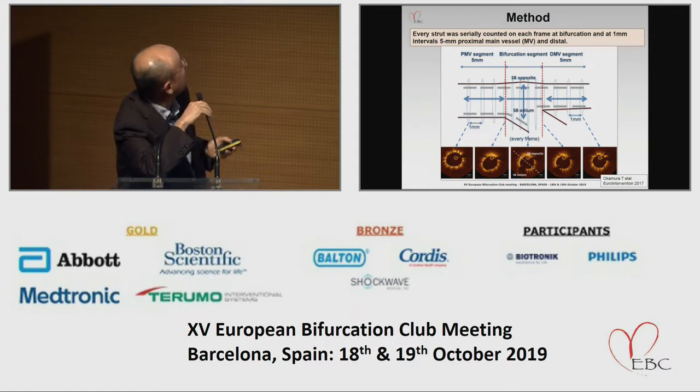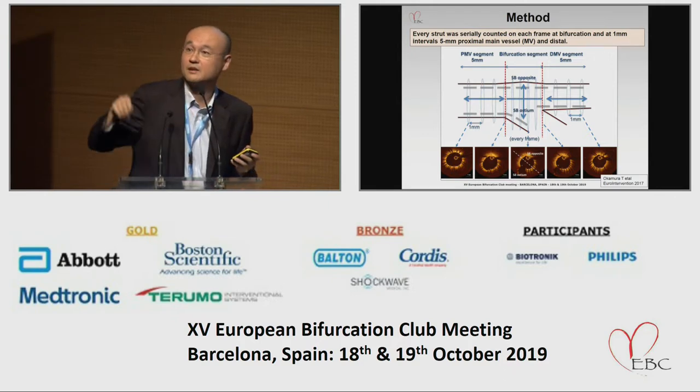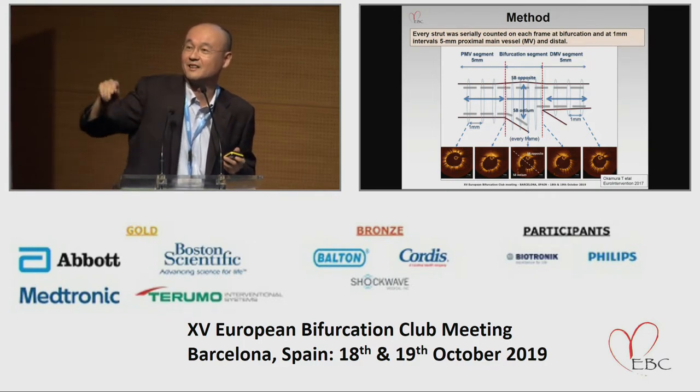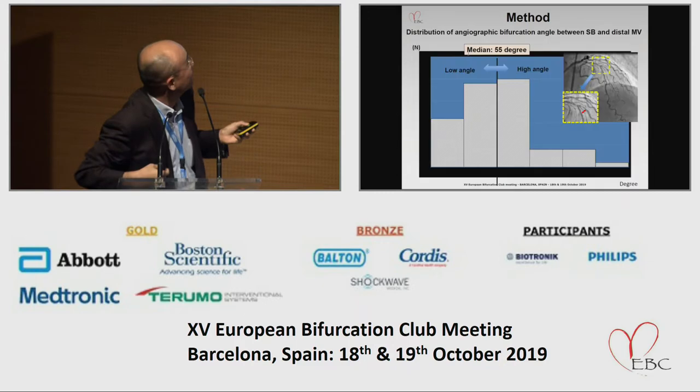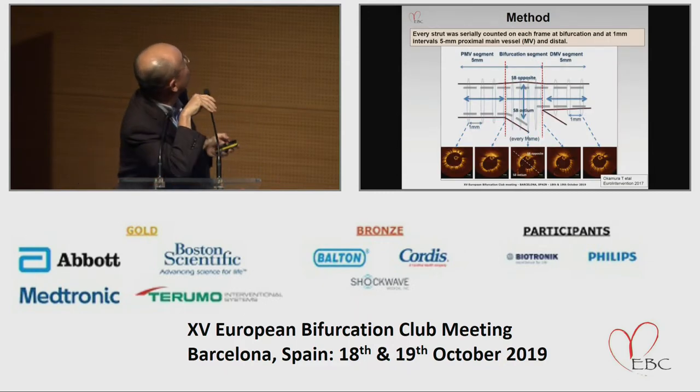In this registry, every strut was serially counted on each frame at the bifurcation and at 1 millimeter intervals in the proximal main vessel and distal main vessel in the core laboratory. Sorry, this is a previous slide, not updated.